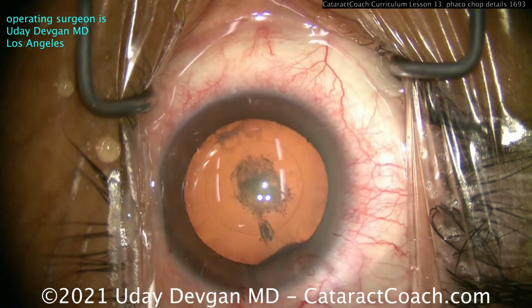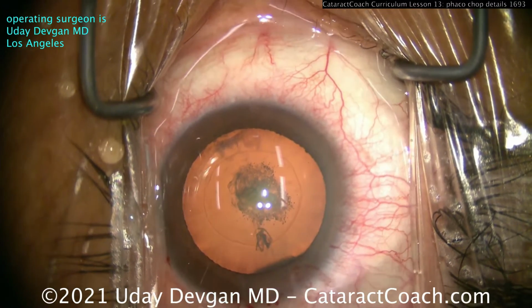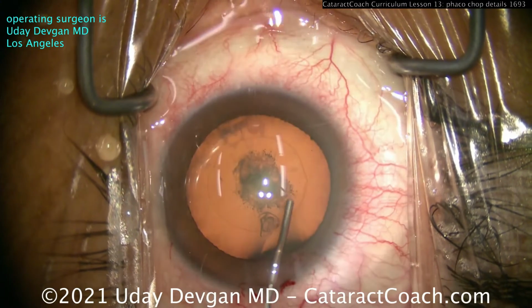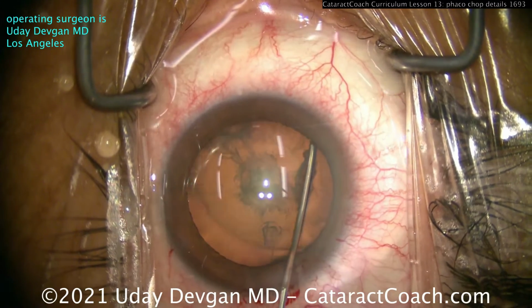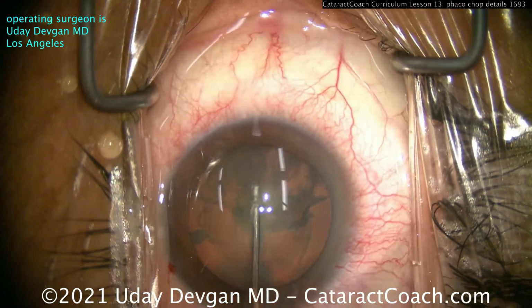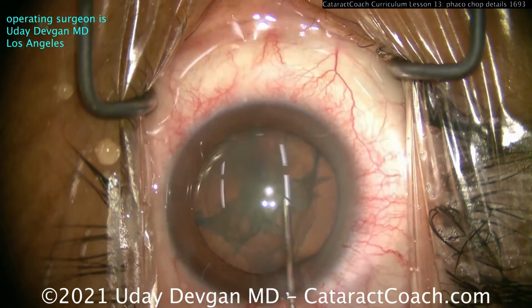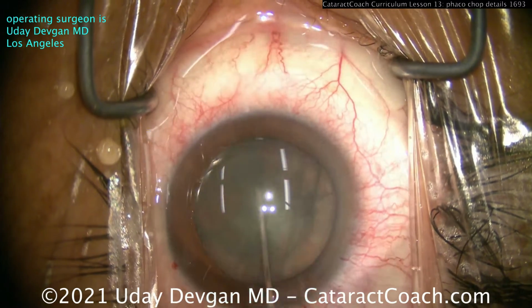Here's the capsular rexus, normal 5mm, looks fine. This lens doesn't have too much nuclear density. You can see it's primarily a posterior subcapsular cataract. So we'll do some gentle hydrodissection. Now, my normal method in a soft lens is to do some hydrodissection, hydrodelineation, and get the nucleus out of the capsular bag. But we're not going to do that today.